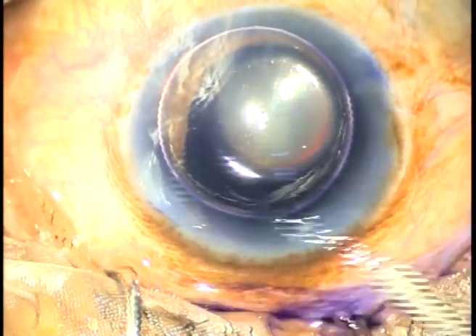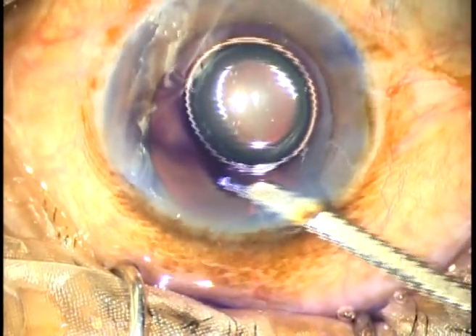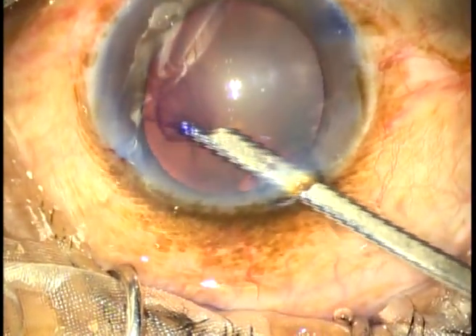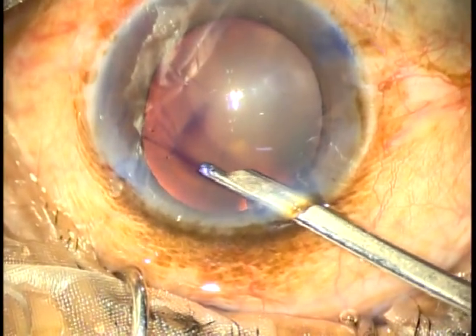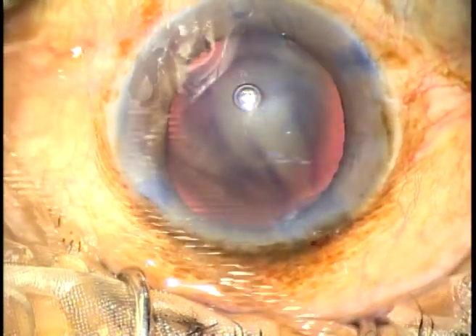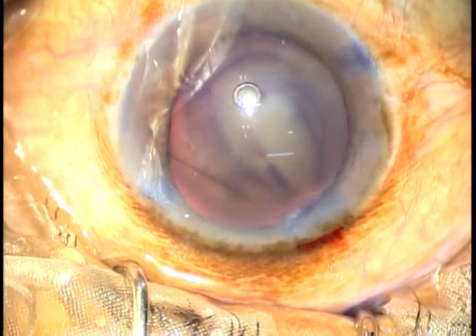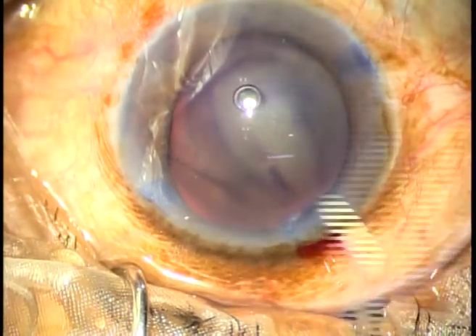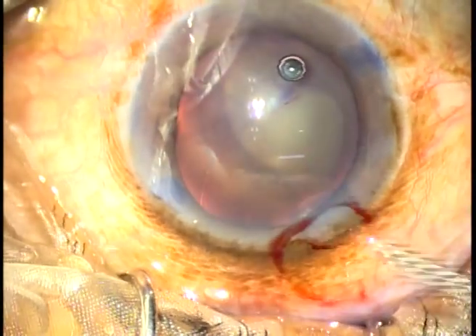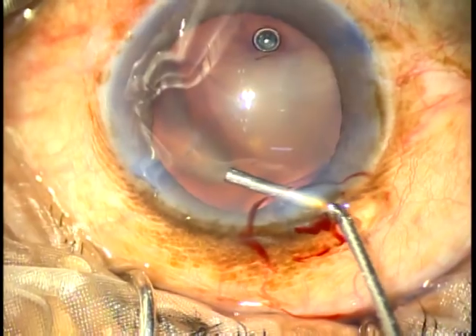Friends, let us observe this cataract surgery. As I wash the trypan blue dye out with BSS, I find that vitreous strands are coming at the aspirating port of the Simcoe cannula. So I flush out these vitreous strands, come out, inject viscoelastic substance — 2% hydroxypropyl methylcellulose. I inject HPMC and push all the vitreous strands inferiorly.